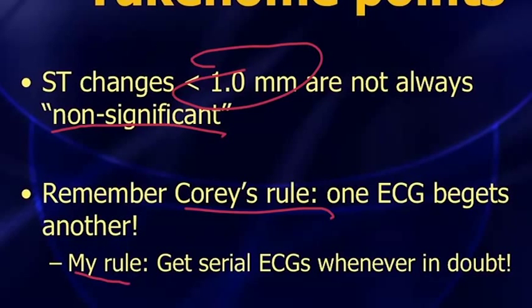It's the cheapest test we've got in the emergency department, and yet it gives you life-saving information. What's the problem with just getting one or two more EKGs whenever you have any doubt or the patient's having some persistent symptoms? And then the final take-home point here, beware ST elevation in lead AVR.